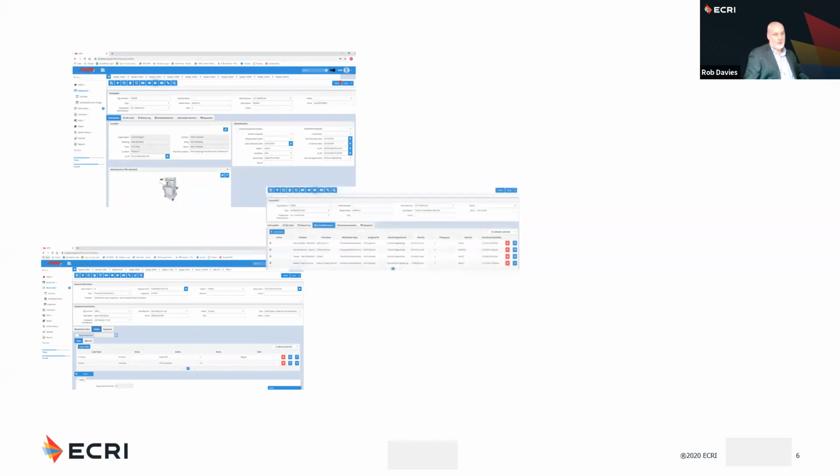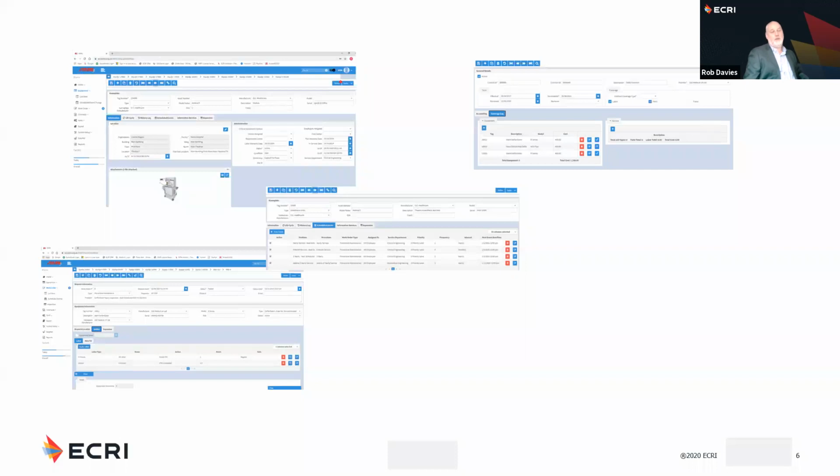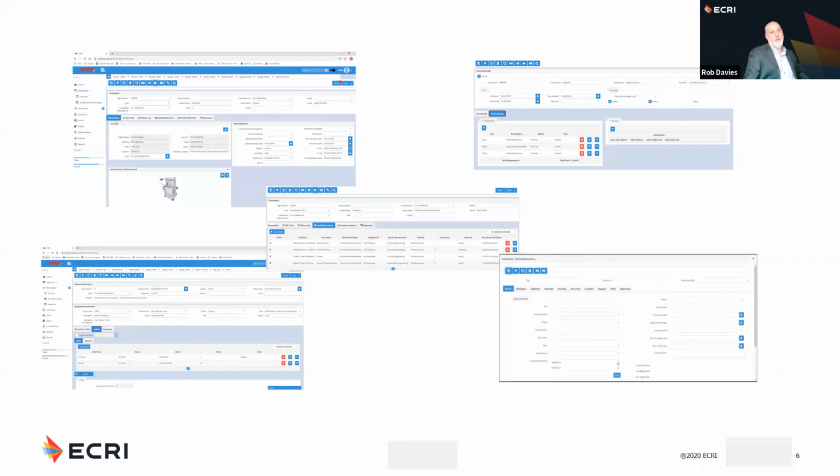The information that we're storing is also becoming more detailed. We're storing huge amounts of equipment information, service history for the equipment over its full life cycle, detailed and sophisticated planned maintenance schedules for different events that happen to the equipment throughout its life, detailed contracts for outsourced maintenance, making sure that we're quality assuring that and the vendors are delivering what they should be. And with the merging, very much more so nowadays, of medical devices and IT systems, we're storing much more in terms of IT information relating to medical devices.